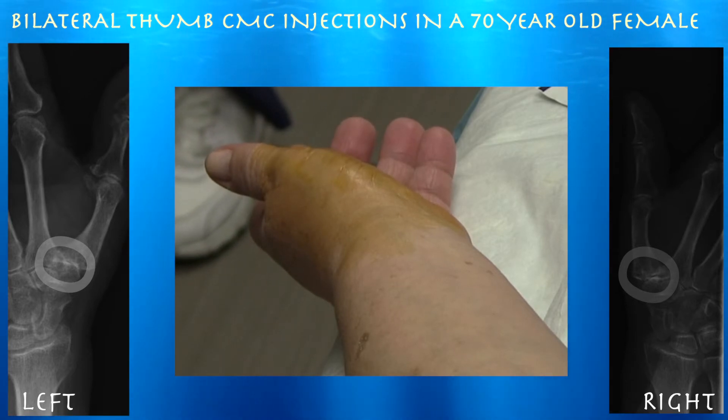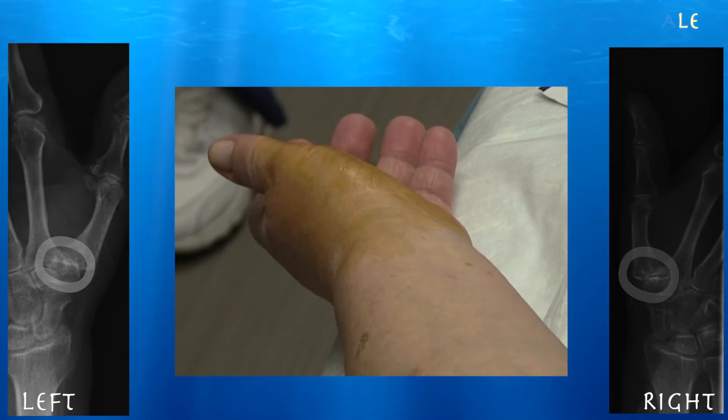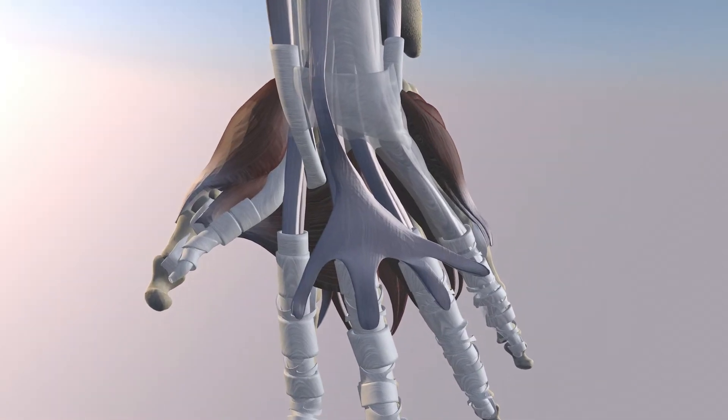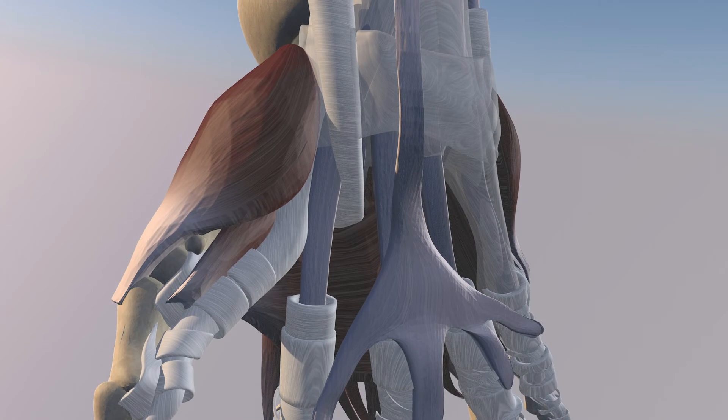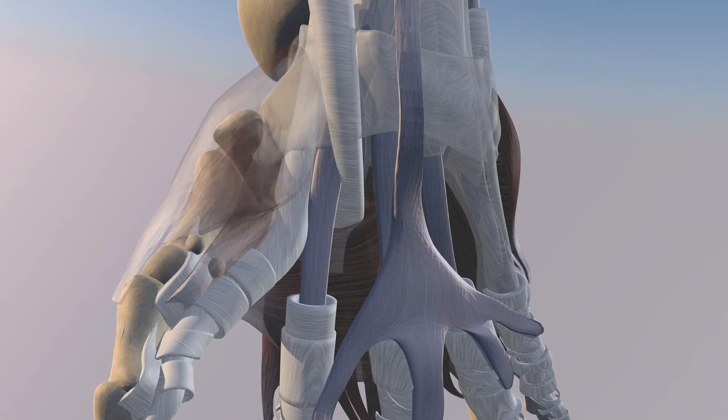We're going to use ultrasound guidance to help guide the needle into that joint. We're going to go over first CMC joint injection — a very common injection in the office. Here we can see the thenar musculature, which we're making translucent, and now we can focus on the first CMC joint.